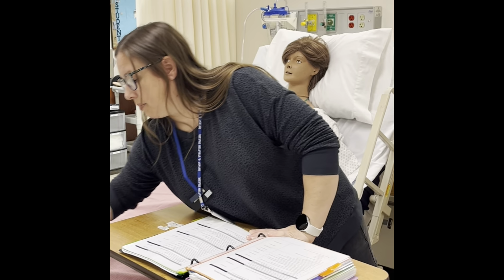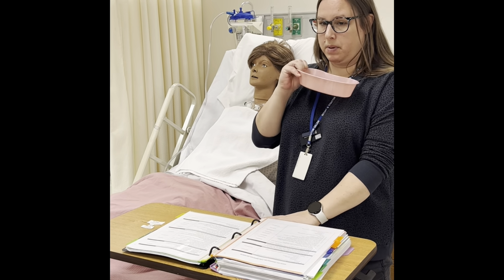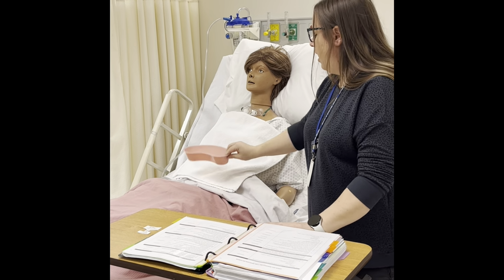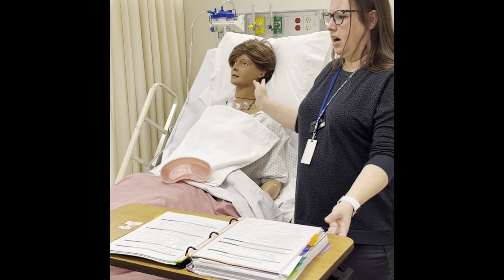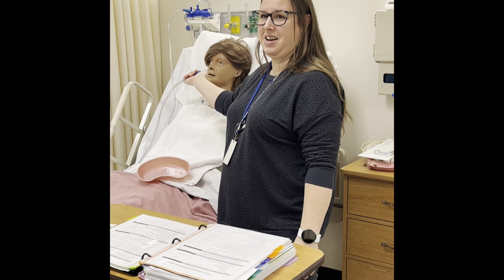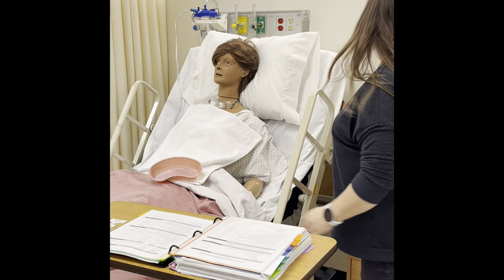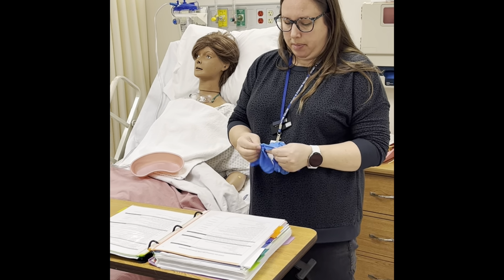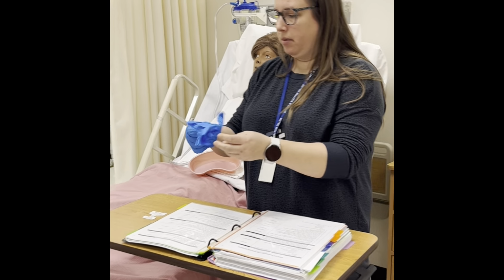Give your patient the emesis basin. Okay, again, who's throwing up in this? Nobody. We're spitting mouthwash in here, brushing our teeth. Nobody's throwing up in this. Bath basin or the blue bags, like I always offer people. Again, the suction, I usually have the thing on, they're gonna puke. Now we're gonna put our gloves on, and then we are going to grab the pen light that's on the table.